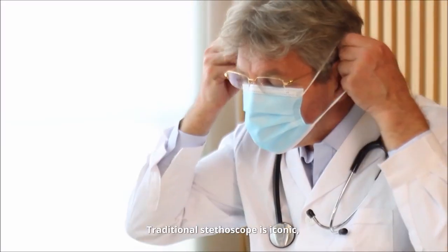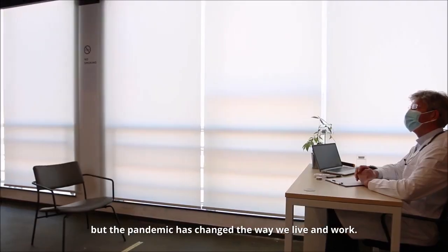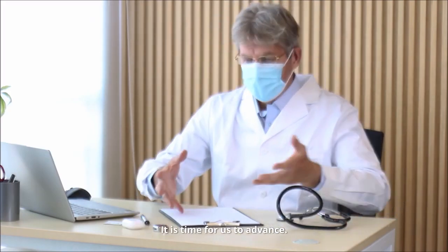Traditional stethoscope is iconic, but the pandemic has changed the way we live and work. Cross-infection needs to be avoided. Auscultation from a distance is safe and beneficial. Compliance with the PPE protocol is needed. It is time for us to advance.